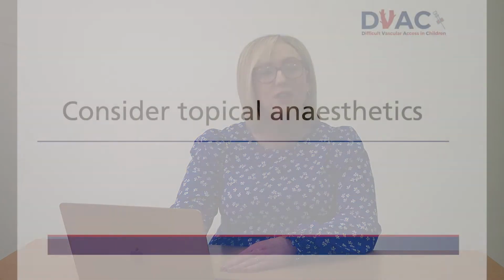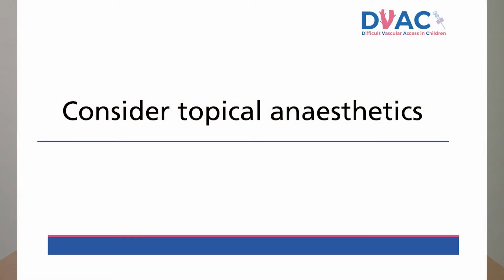Preparation. Consider topical anaesthetics. Prior to cannulation, you might want to give consideration to the use of topical anaesthetics. When used correctly, they can be extremely helpful in minimising pain for the procedure for their patients. You have a number of choices for this, and this might depend on what your clinical area stocks. If you make yourself familiar with what you have, you can use these to your maximum benefit.